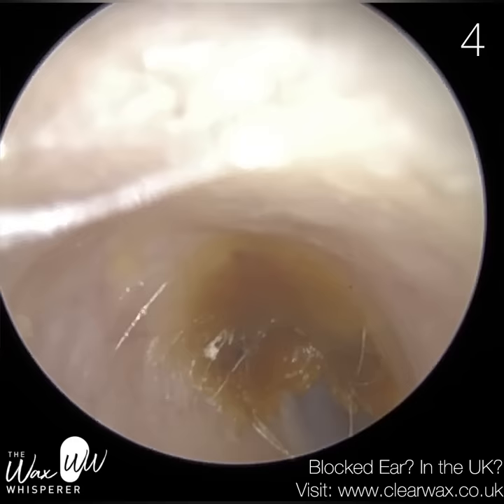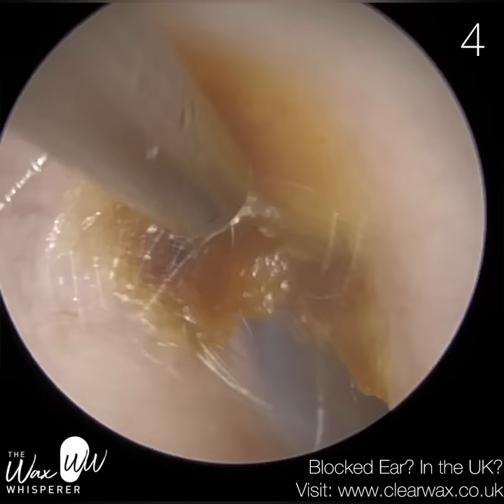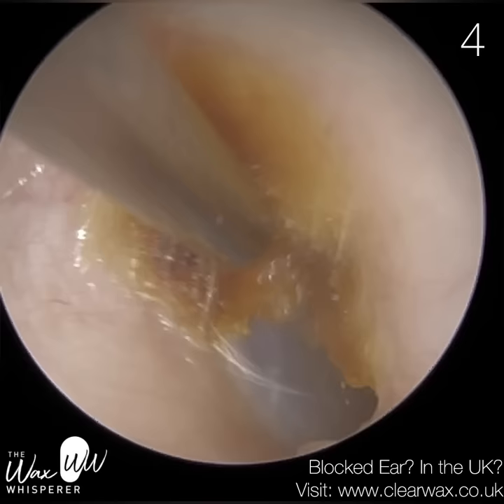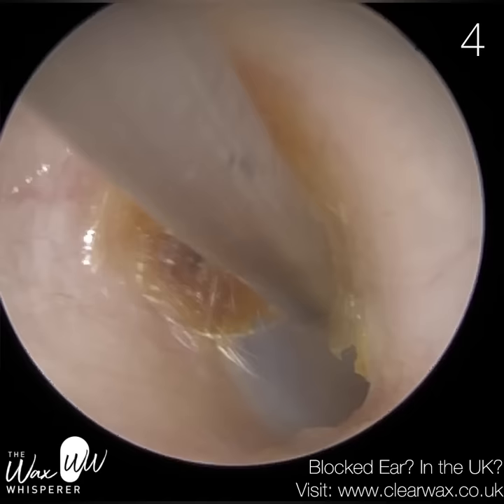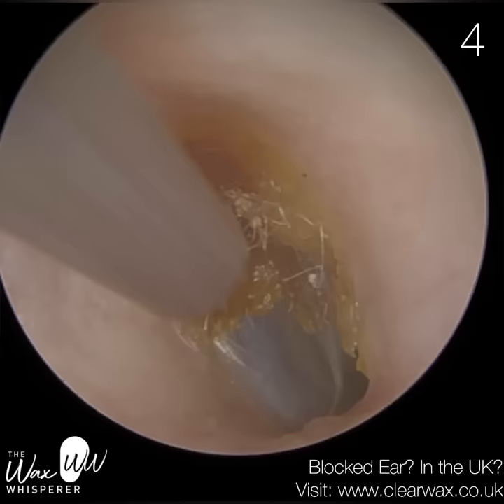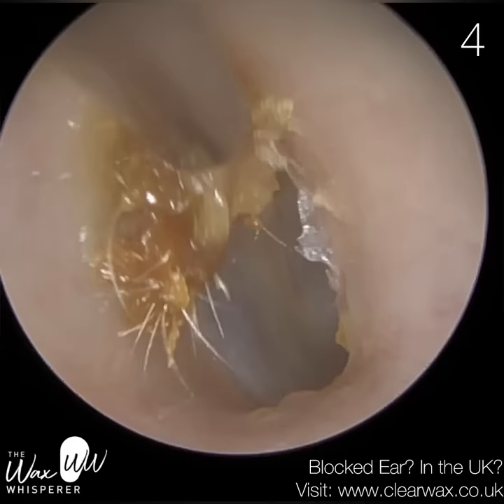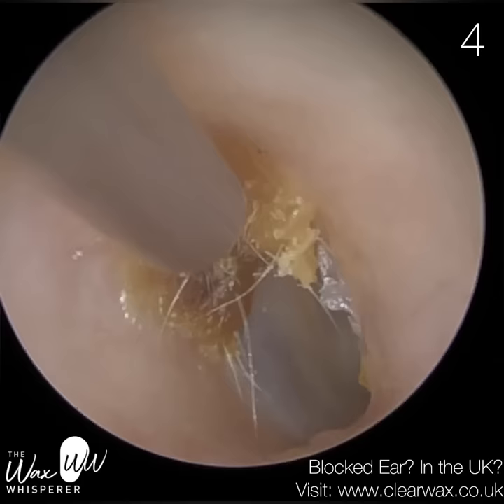This is patient four — really crusted earwax, deep in the ear. They are a hearing aid wearer, and the hearing aid is squealing. When you've got an occlusion in the ear and you wear a hearing aid, the amplified sound reflects back out of the ear off the debris — whether it's skin, earwax, or infection — and re-enters the hearing aid microphone. The hearing aid re-amplifies a sound that's already been amplified, and this cycle continues, creating what we call a feedback loop. If ever you see — or hear — a person whose hearing aids are whistling, it could be because they're not fully inserted, causing acoustic leakage, or because their ears are blocked and need unblocking.